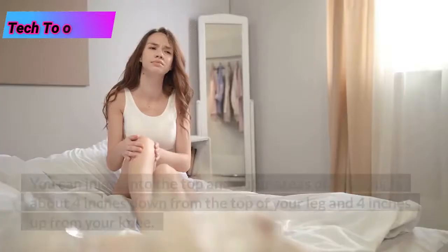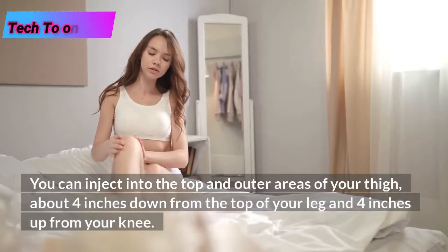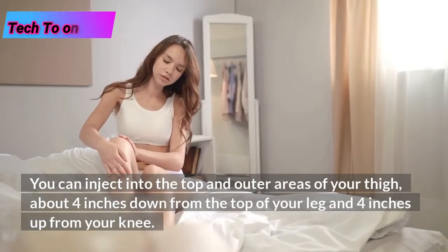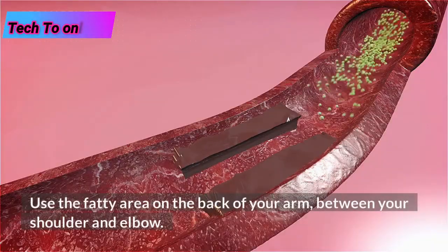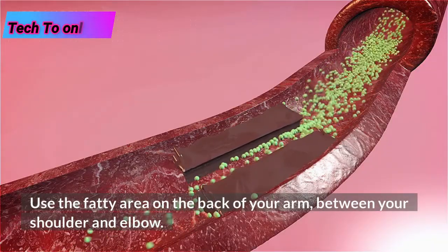Thigh. You can inject into the top and outer areas of your thigh, about 4 inches down from the top of your leg and 4 inches up from your knee. Arm. Use the fatty area on the back of your arm, between your shoulder and elbow.